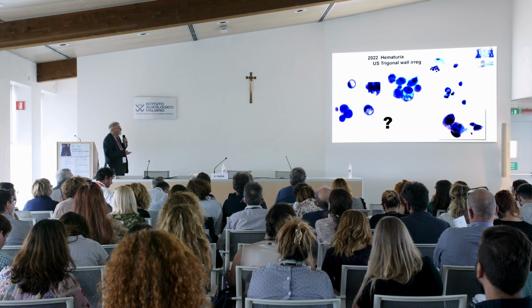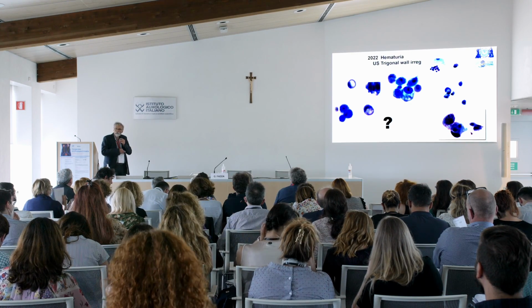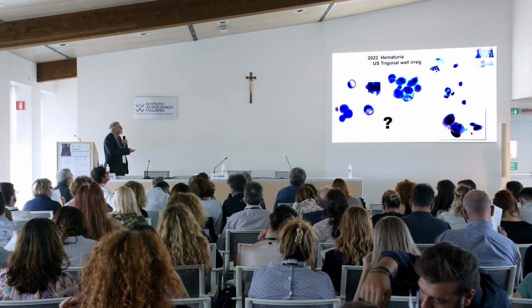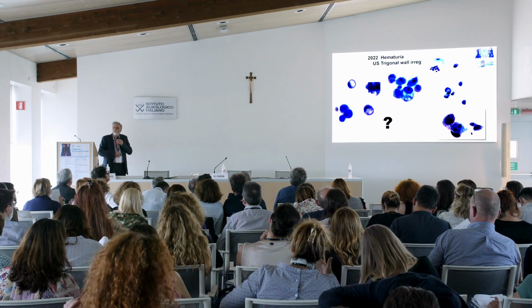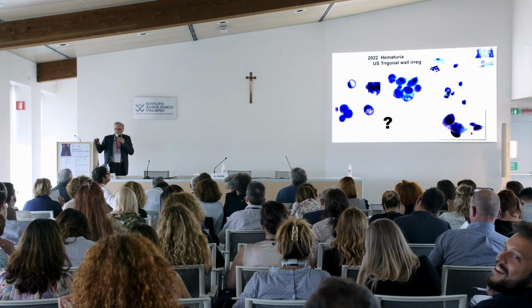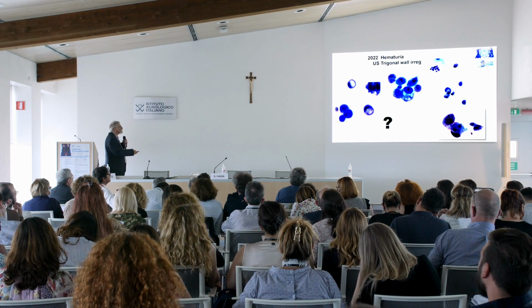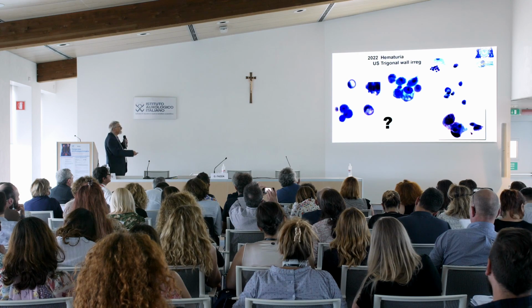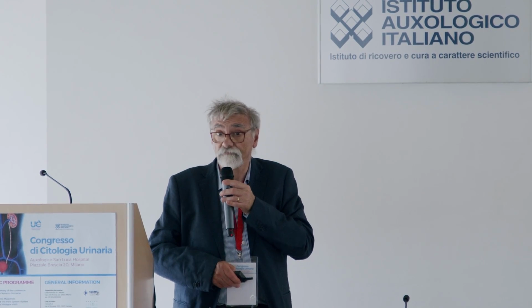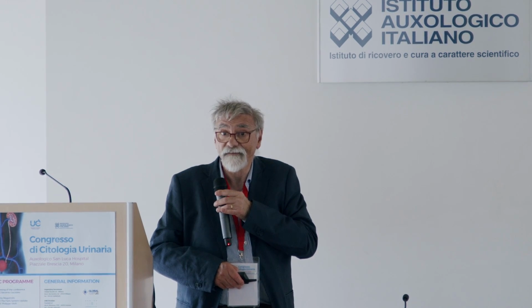I had no other comment about that because why this aspect? Histology 1 month later was very clear. It became very easy. But at the moment of cytology, why this aspect, reminding of signet ring cells? Maybe?